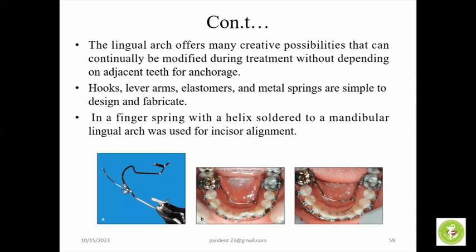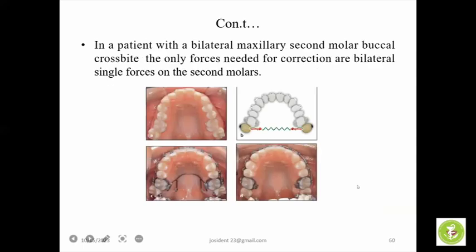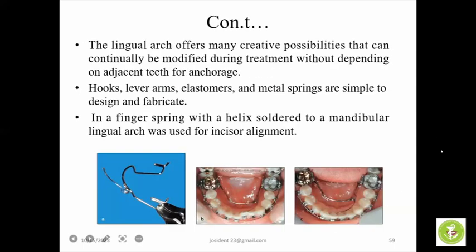As you can see in this picture, they have used a soldered finger spring on the passive lingual arch. You can see here there is a lingually displaced central incisor. So they have a passive lingual arch and they soldered this finger spring to it. There is a continuously applied force from the finger spring to the lingually displaced central incisor, so that it will come into place without any further displacement of adjacent teeth because of a strong anchorage received bilaterally from two molars. So the tooth is well in place, with no displacement of the adjacent teeth.